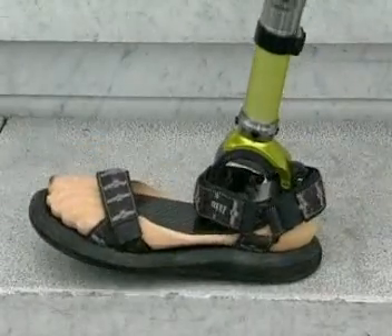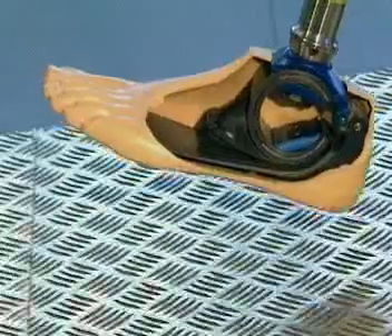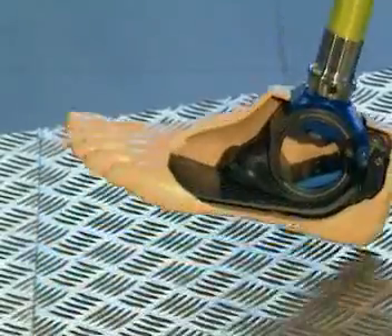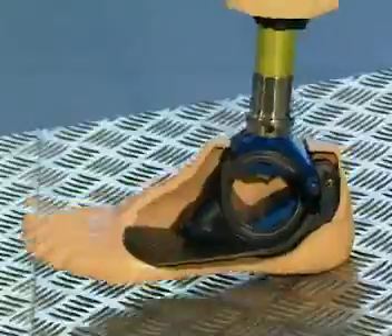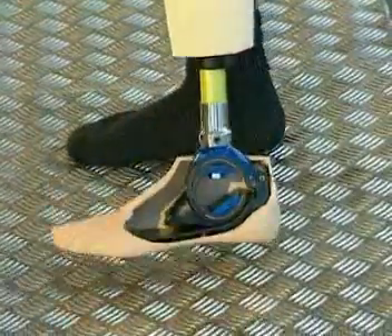The extensive plantar flexion movement of this foot is most easily noted during loading response immediately following heel strike. This cutaway of the shell shows the individual elements of the foot.